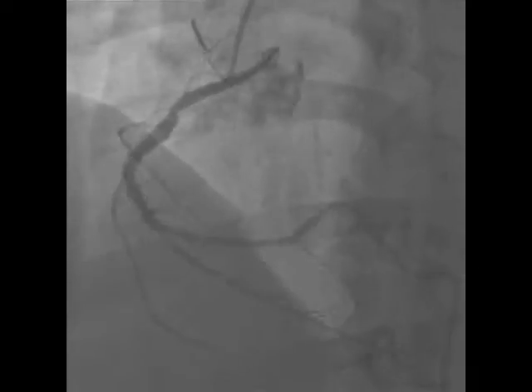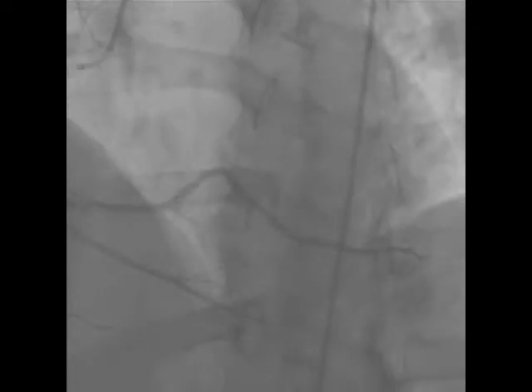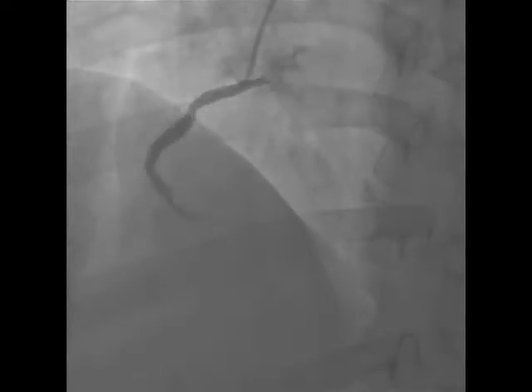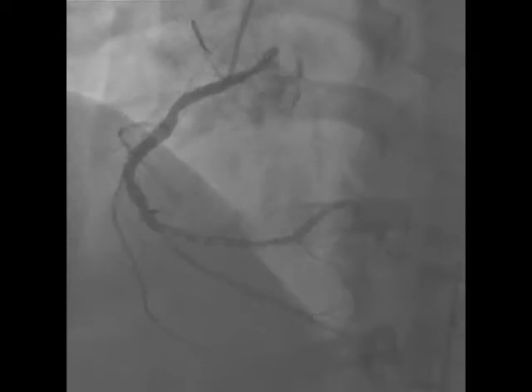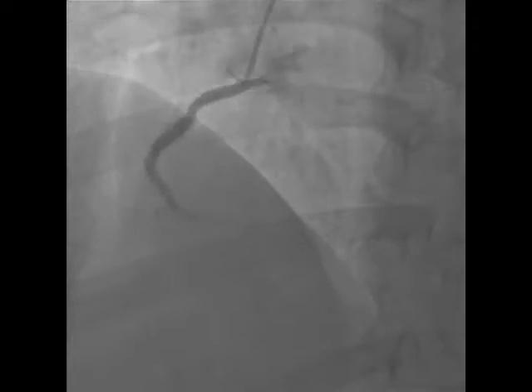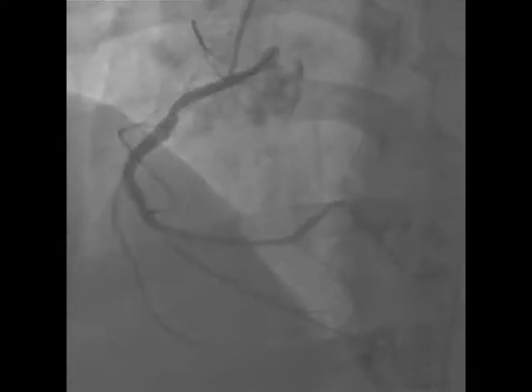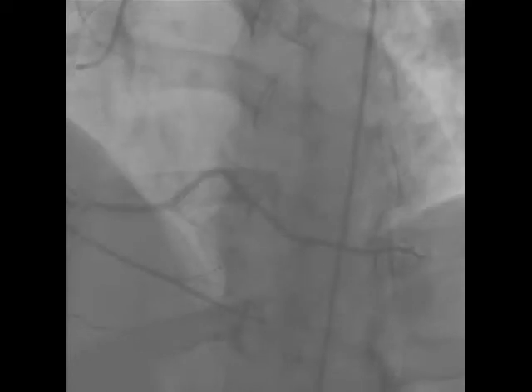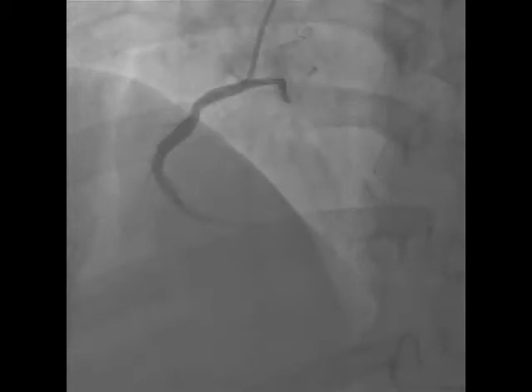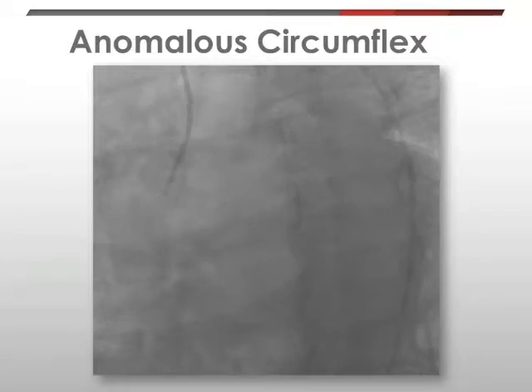Next, I performed selective angiography of the right coronary artery, which demonstrates mild to moderate disease of the proximal and mid-RCA, and a ruptured plaque with severe stenosis and associated thrombus in the distal RCA.